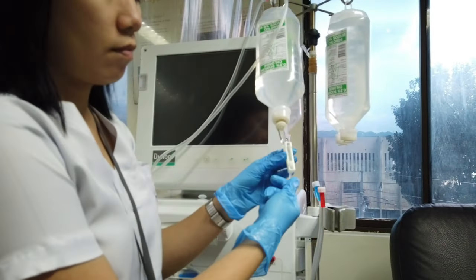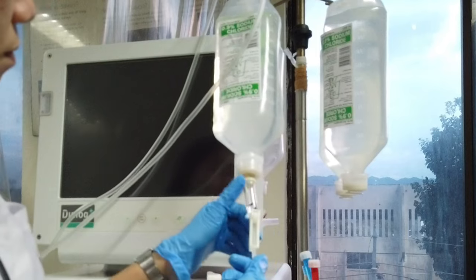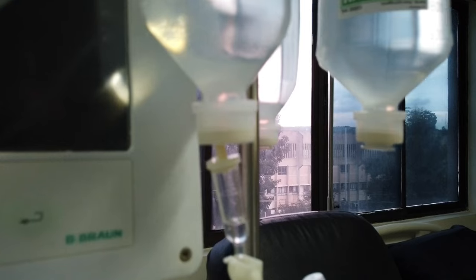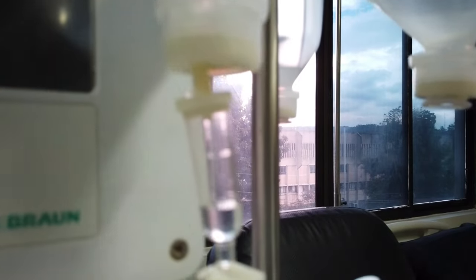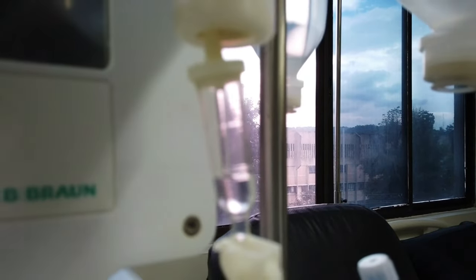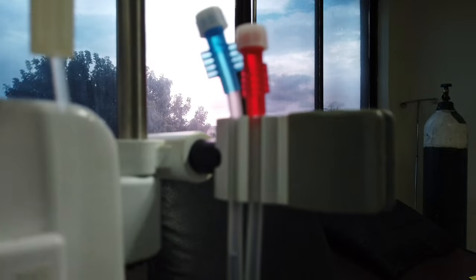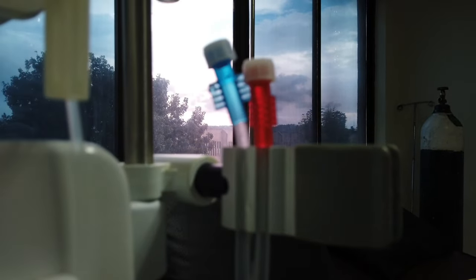Now let's prime. Open the roller clamp, press the saline to assist in filling the venous line with saline by gravity. Observe the lines, and once the saline reaches the venous dialyzer end, close the big venous clamp.